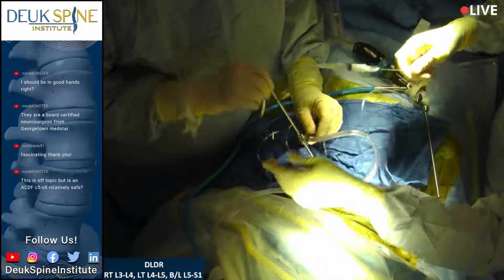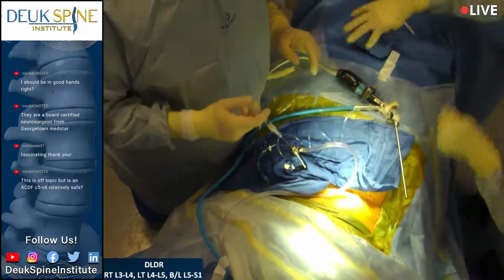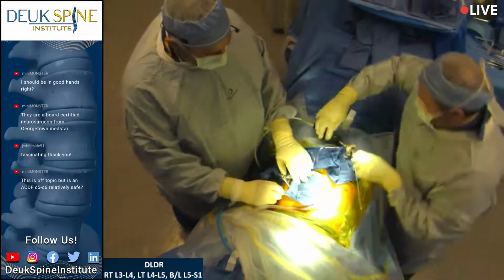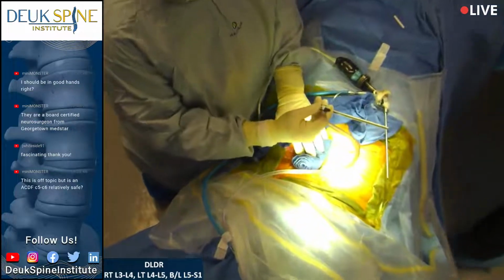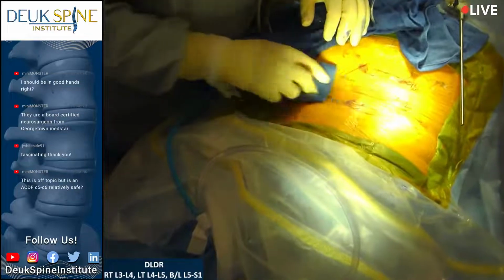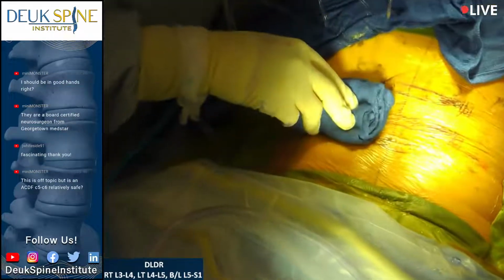Yeah. The patient had a few PVCs, which is good. We got the disc we wanted to get done. So here you go. All right, she's done fantastic. And you can see there are 2 incisions, one on each side.